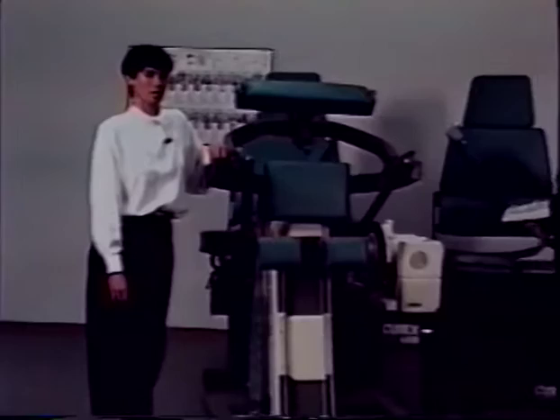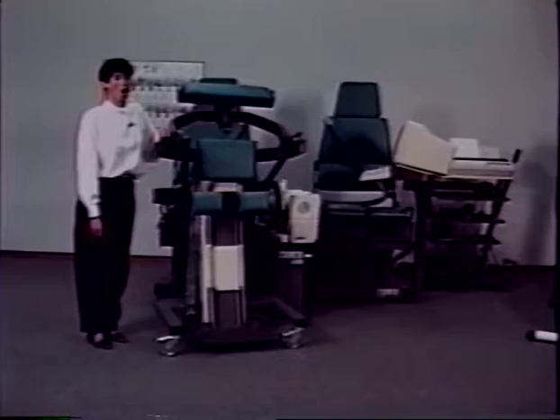For proper patient setup, step-by-step instructions are located in the client's setup record. There is room to record each of the adjustments on the setup record. All adjustments can be made from either side of the TEF modular component.